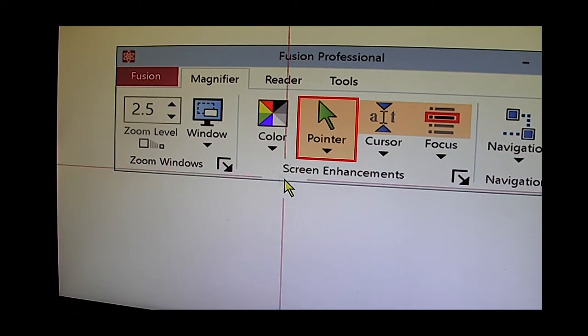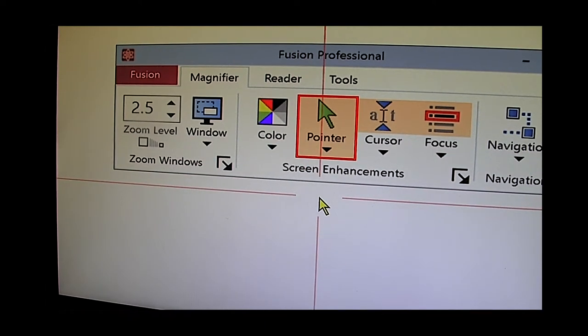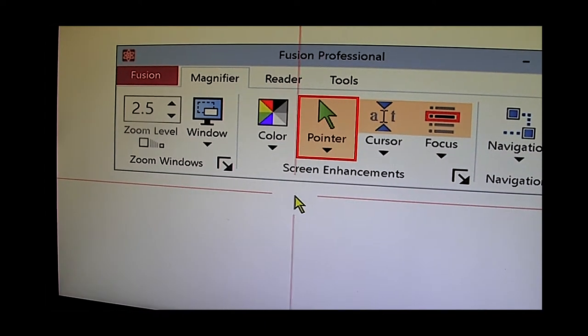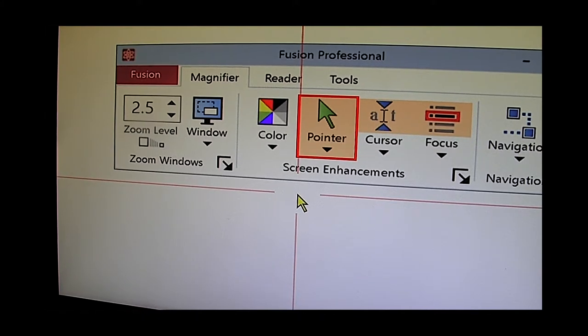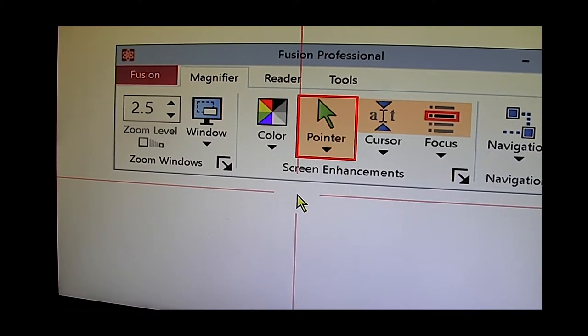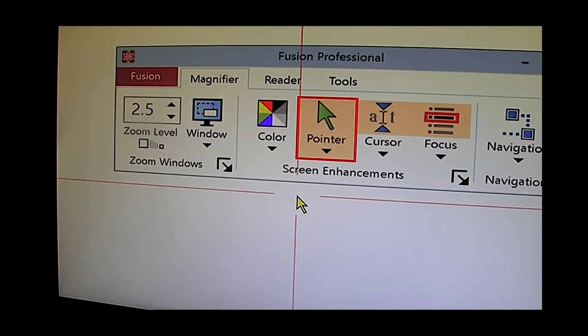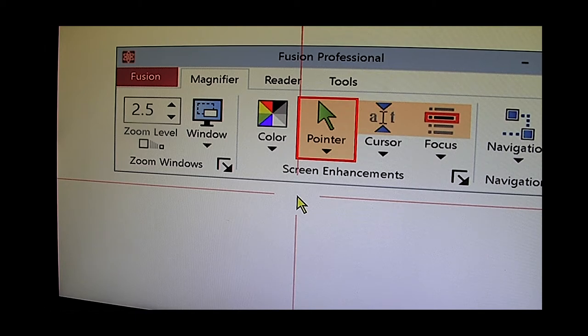For example this one here we have some crosshairs that point directly attention to the mouse pointer. That's very very useful for people with RP or other forms of tunnel vision. They look for a line. They follow the red line and they find the mouse pointer.